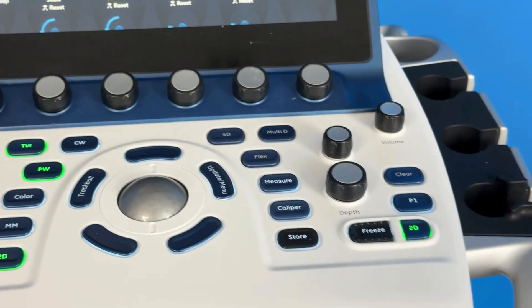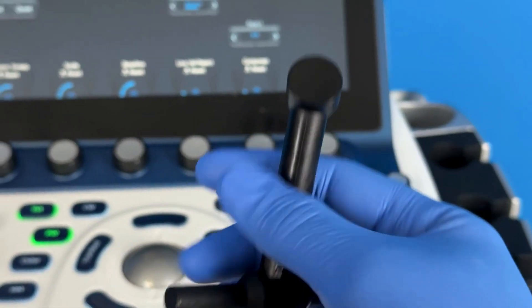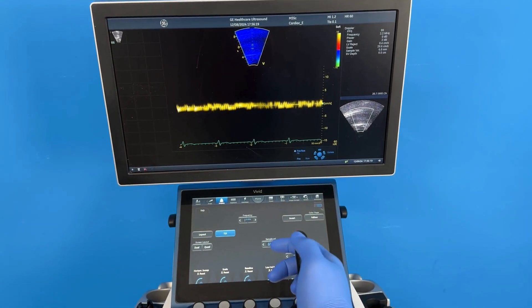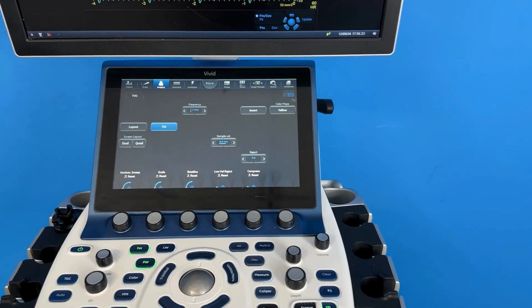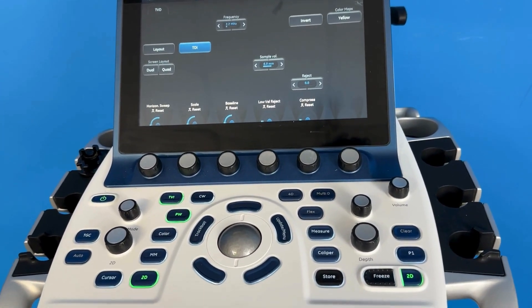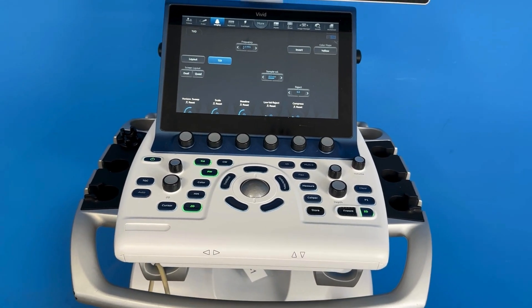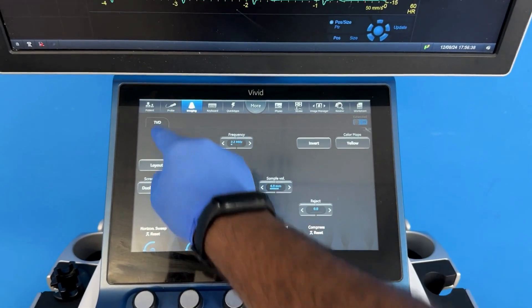This is the P2D, to check the sound. Let me change the probe.